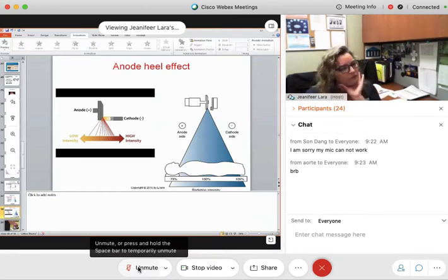Okay? Or think about your toes. That's where you'll see it again. Your toes are thin. Your foot is thick, right? And especially because of that arch. So you have thick. That anode heel effect would be appropriate there.